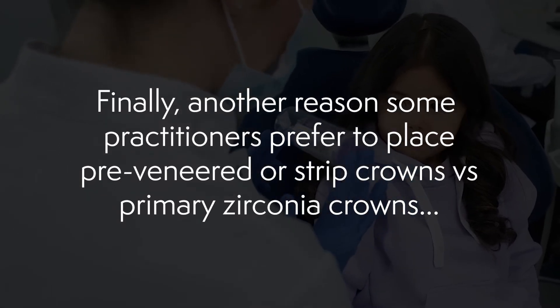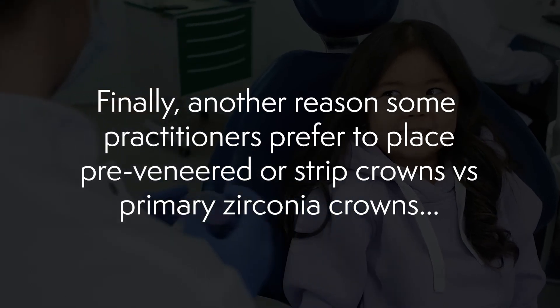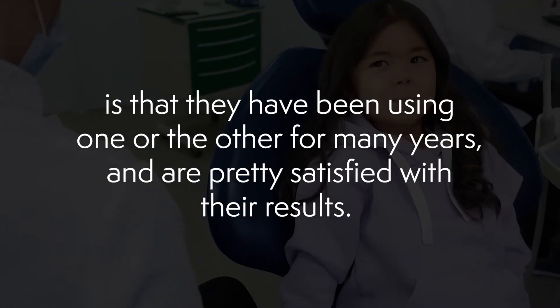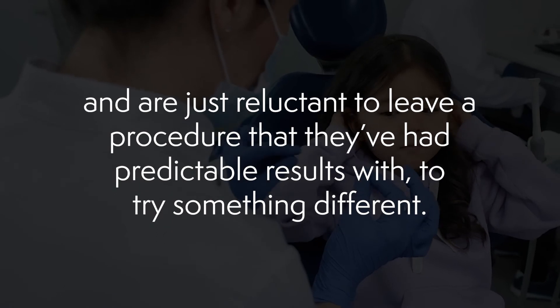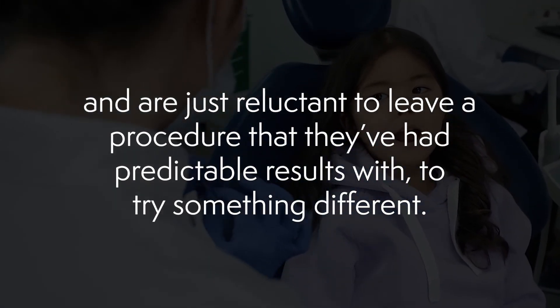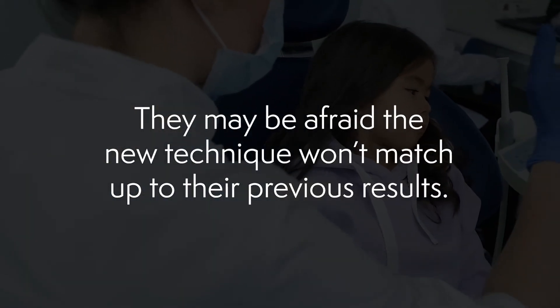Finally, another reason some practitioners prefer to place pre-veneered or strip crowns versus primary zirconia crowns is that they've been using one or the other for many years, are pretty satisfied with the results, and are reluctant to leave a procedure with predictable outcomes to try something different. They're afraid the new technique won't match up to their previous results.